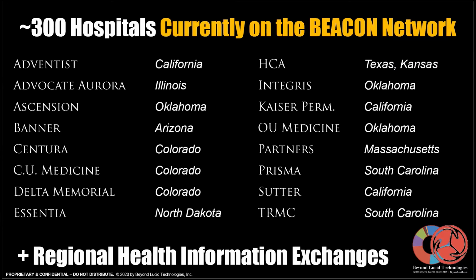By the way, when I refer to hospitals in this video, I'm using a shorthand for any care facility or other entity that can be legally granted access to mobile medical data with the appropriate authorization. This can include clinics, nursing homes, rehabilitation facilities, doctors' offices, even non-clinical partners like coroners and public health agencies.